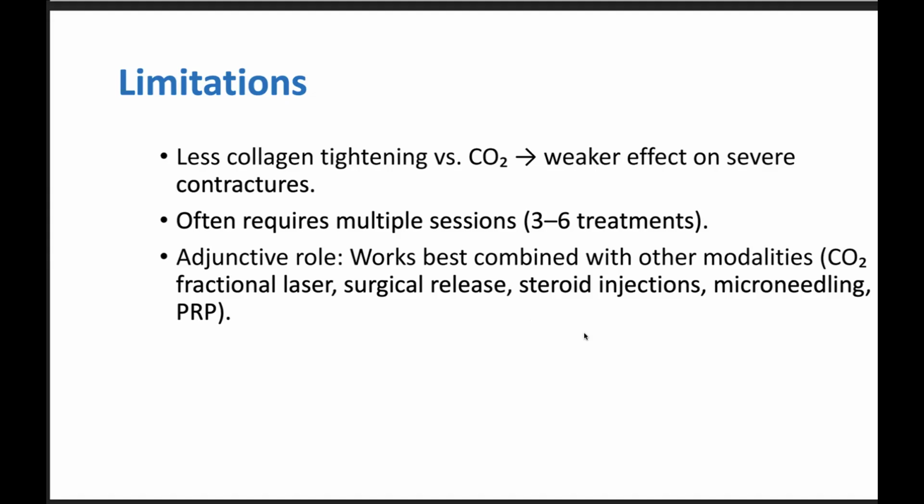The adjunctive roles: when the scar is more severely contracted around the joint area, it may be combined with CO2 laser or surgical release, steroid injection, microneedling, etc. So, scar treatment is a very difficult topic. It requires a lot of work. Next slide.